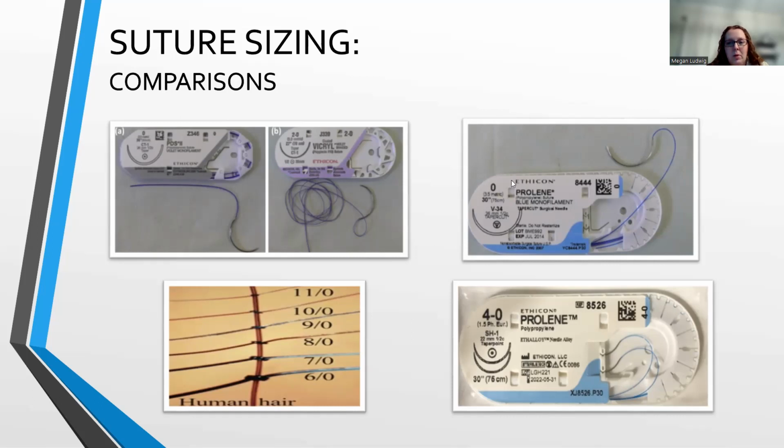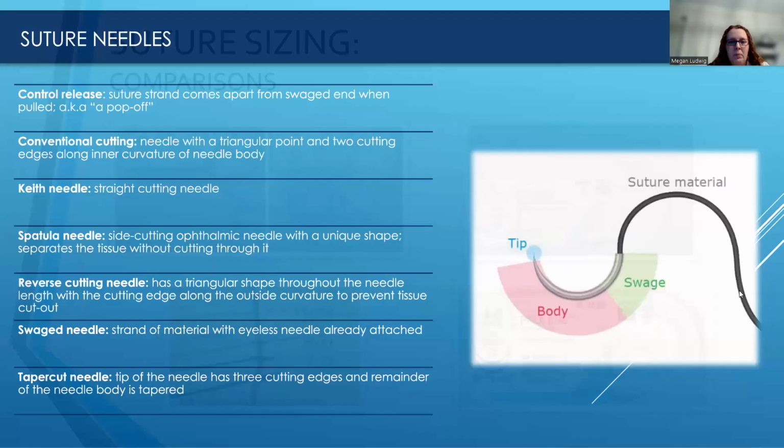You've got the size, the diameter of the strand. So like here, this 4-0 Prolene has pictures of 2 needles, so there should be 2 in here. When you go to count those, these are a countable item. You must always visualize your needles to see what you're counting. So I like this little picture. It does show you. Then down the middle is that human hair, so it gives you some perspective there. And we're going to look at suture packets here in a little bit as well.